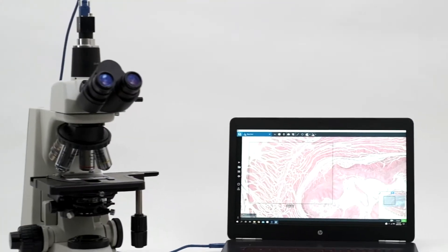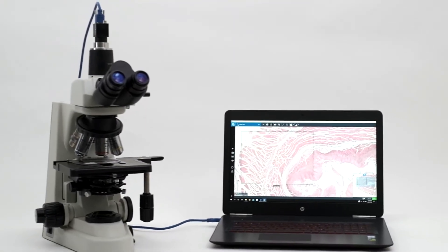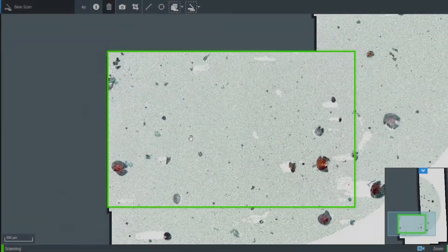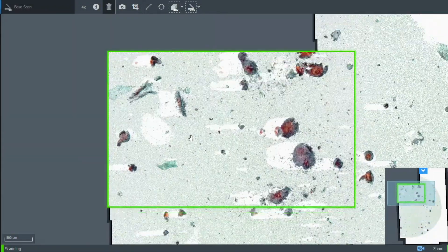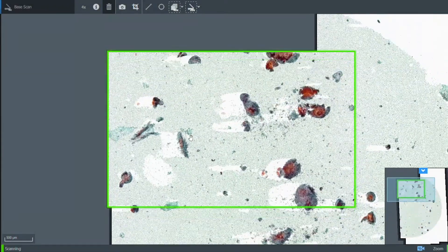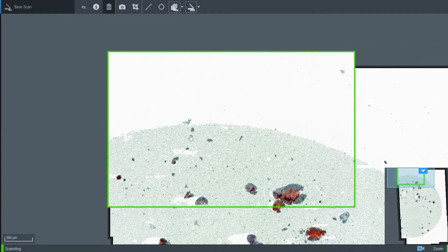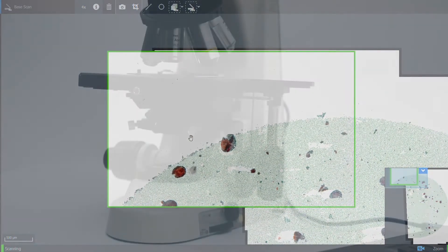Designed to integrate seamlessly into the laboratory's existing workflow, Panoptic's unique software allows pathologists to record and share detailed digital images of samples in real-time.